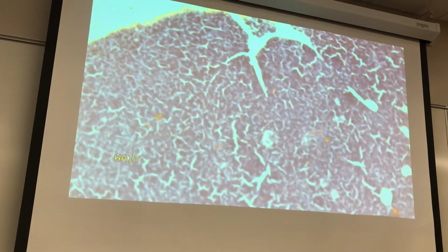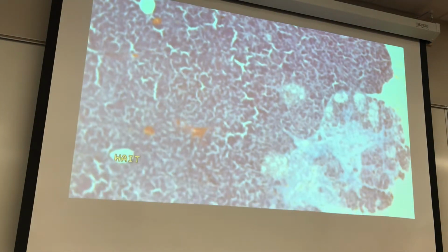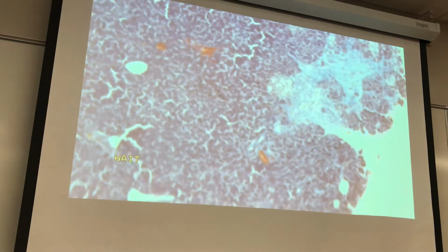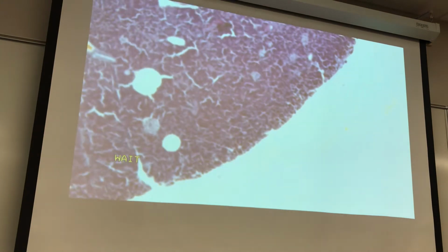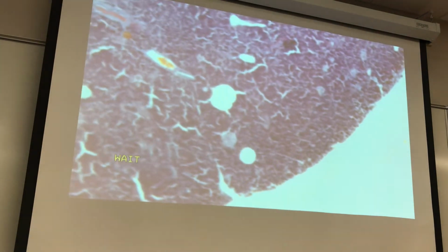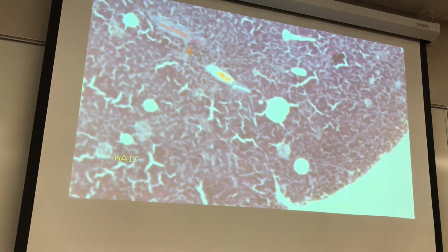This is a pancreas. The pancreas is an exocrine organ and an endocrine organ. By exocrine, that means what? It empties into a... there's one. There's another. You got it. Exocrine means that it empties into what? The blood or a duct? A duct. Exocrine means that it empties into a duct.